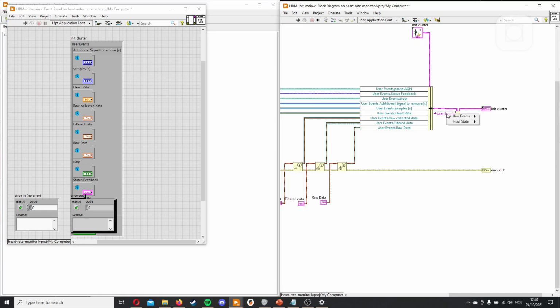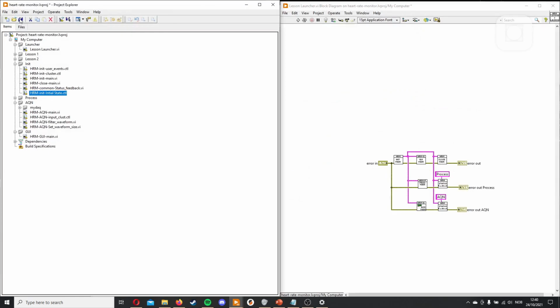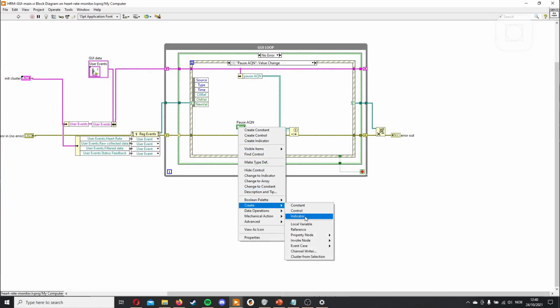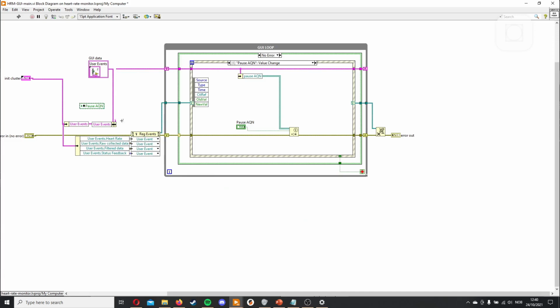Let's set our state here, initial state, pause acquisition, and we want it to be false because we want it to start running, and then we can rather pause it if that's what we want. And since this initiation cluster goes everywhere and this is part of it, now it will automatically go everywhere. This is the power of type defs. That's why it's so important to keep type defs. And we'll go here. We'll create a local variable, put it here. We can move this along a little bit, go up here. We don't need to put it as a GUI data, as they will never read the initial state later. But we can put it here.